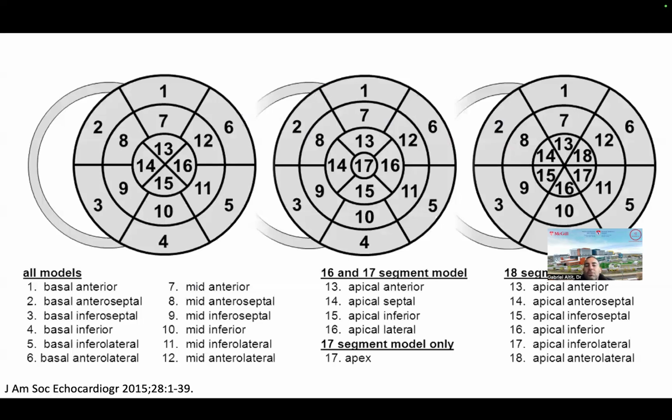So ASE has different models of how to classify these different segments. In neonatology, it's not as frequent that we will speak in segments compared to the adult world, but in the adult world, they have coronary artery disease that may impact specific segments of the ventricles, and that's why it's important for them to understand which segments particularly are being affected. It helps them understand the degree of the coronary artery disease before going to the cath lab for revascularization treatments. But in neonates, you could also have segmental issues.